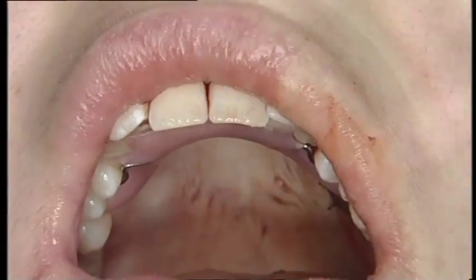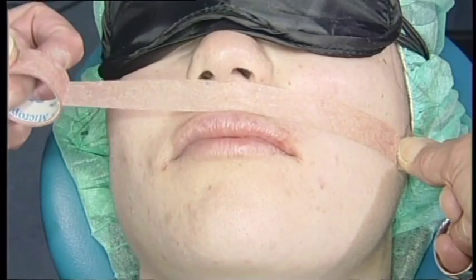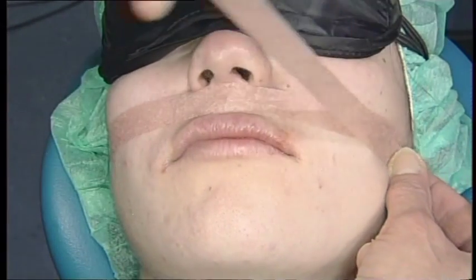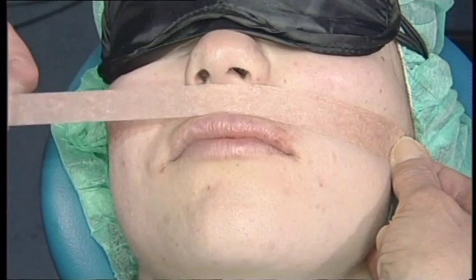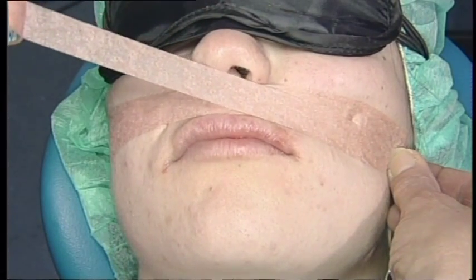After cleaning the patient's face, a pressure dressing is applied extraorally to the upper lip to minimize post-operative swelling. The patient is instructed to apply cold packs in this area. In addition, a perioperative antibiotic coverage is given for 3 days.